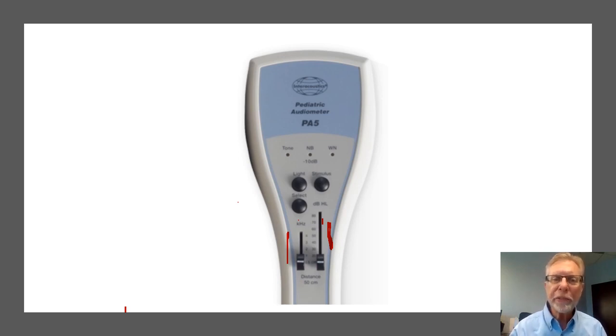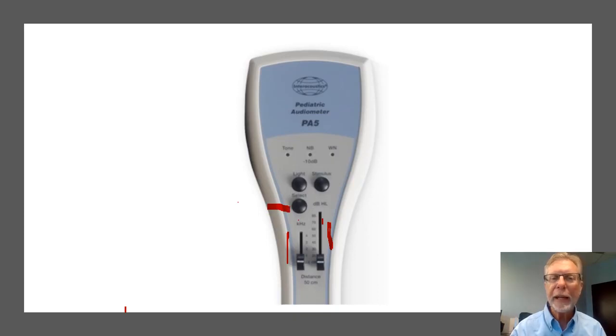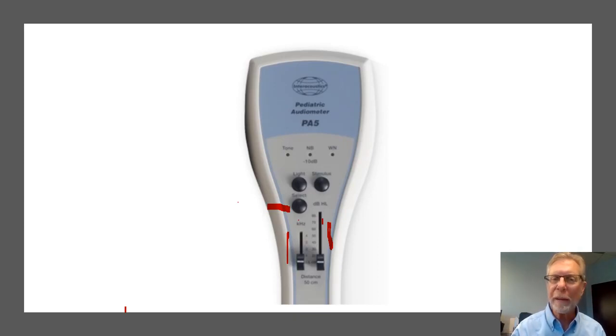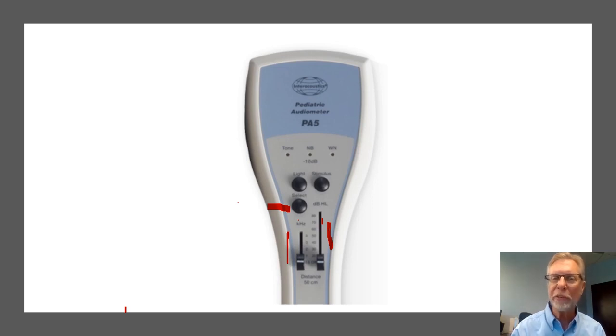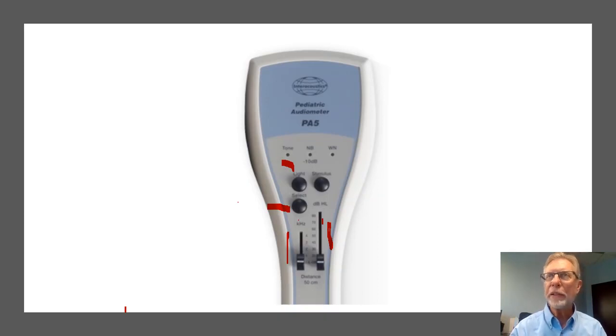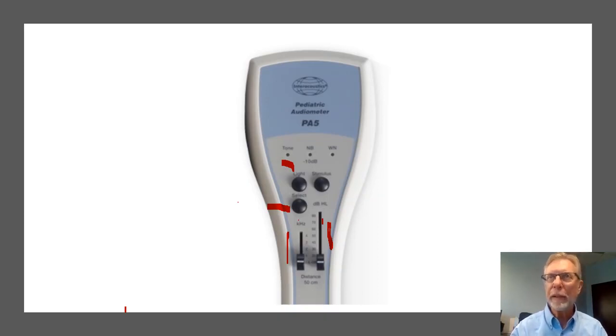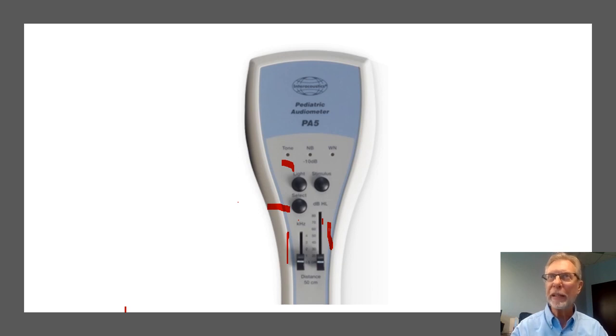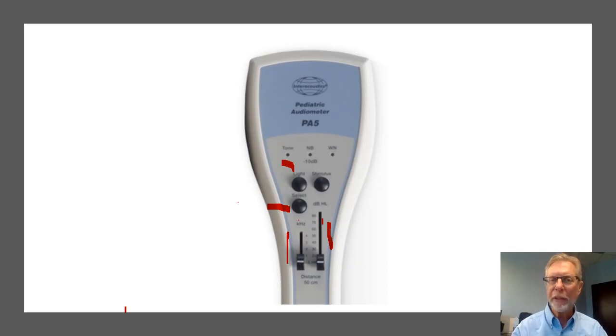Okay, then there's this button over here, right there, and that's the select button where you would select the type of stimulus that you're going to use. And these lights up on the top indicate which stimulus is chosen. It is either a tone, and the tone in this case is a warble tone.